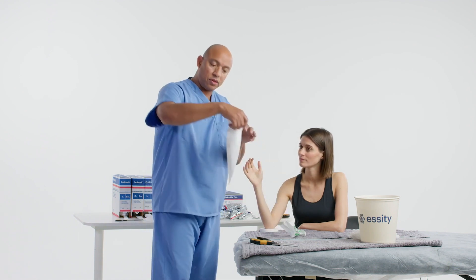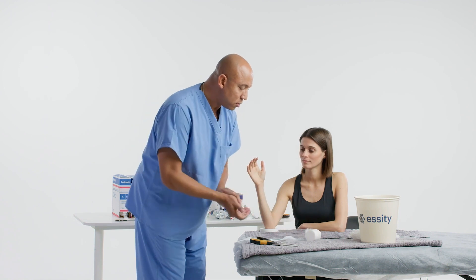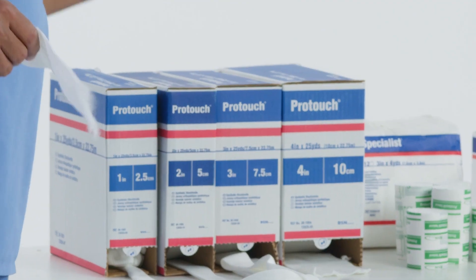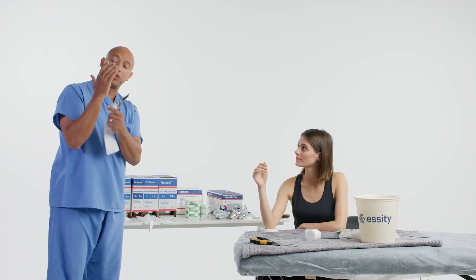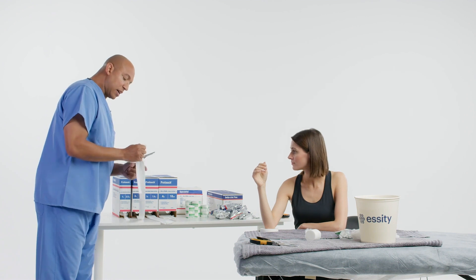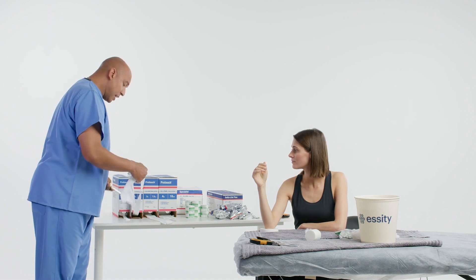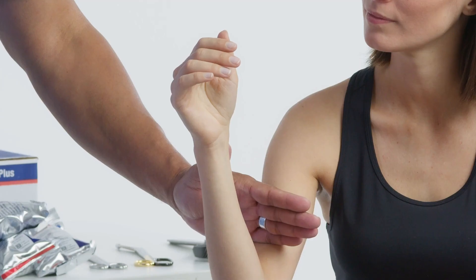Here's our measurement for our stockinette. We'll be using a two inch or a three inch, depending on the diameter of the patient's extremity. It should feel loose on the extremity, but not loose in the joint area where there's a lot of space. You can add on 50 percent extra for the length of your stockinette, adding it in the antecubital space, a little bit above.